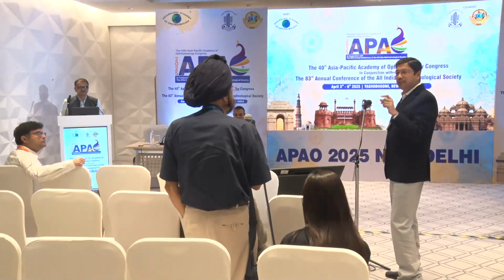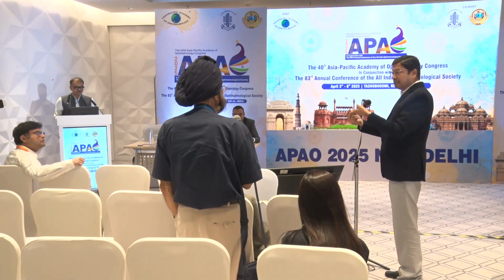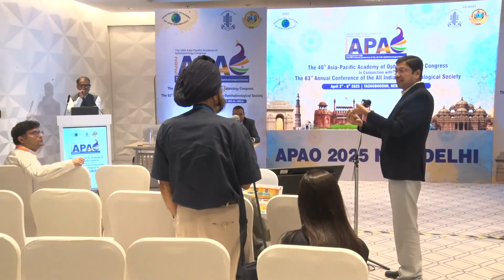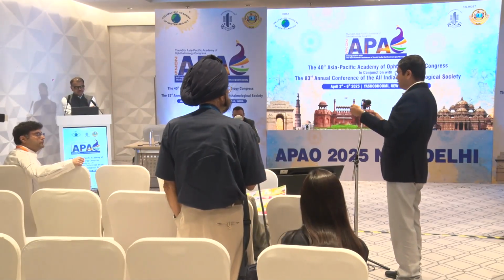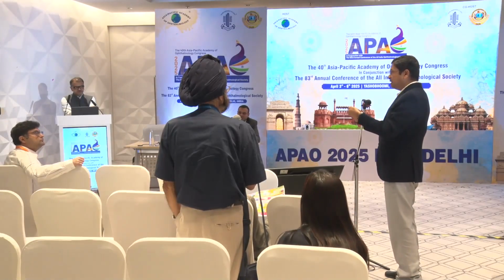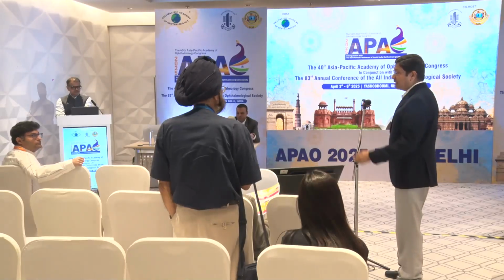There is a good video by Dr. Haldipurkar. He's a good friend. He uses an external light from the side, and he can very beautifully see the claw if the light source is from the side. The microscope light is off. The VR light, the endo illuminator, is from the side, and that transilluminates. That looks very nice.